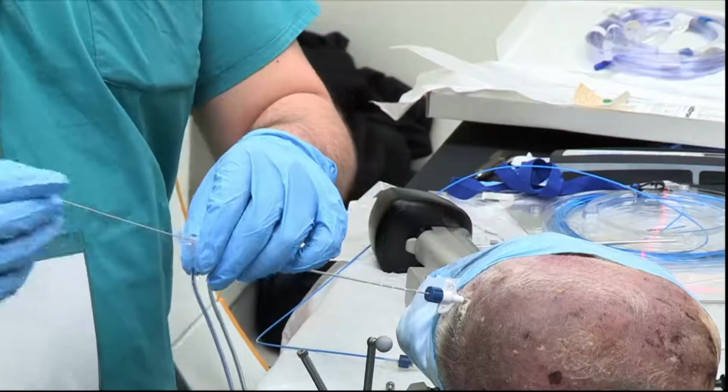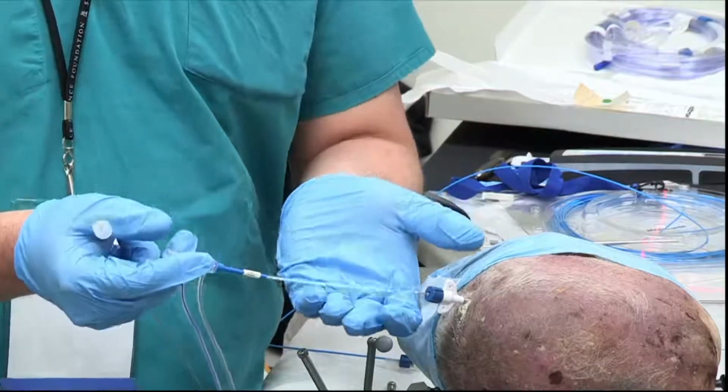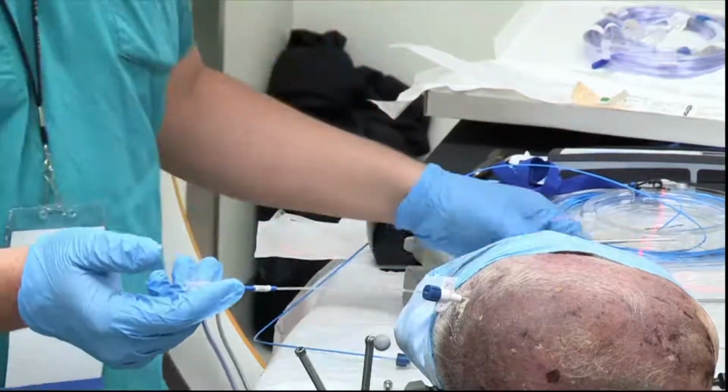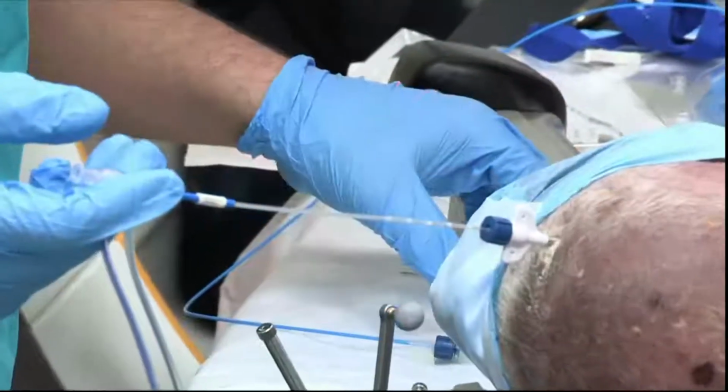We're going to take out our stylet. You're going to hold this up like this. If you drop it, it can bend, and you don't want it to bend a lot. A lot of the case after this in the transport is making sure this doesn't bend a whole lot. So you got to keep an eye on that.